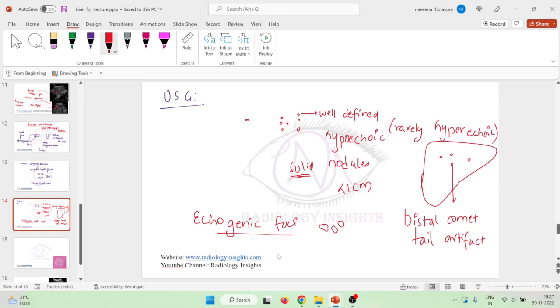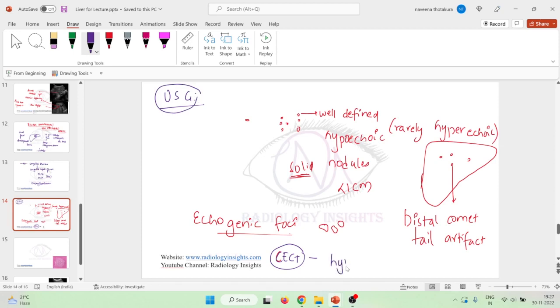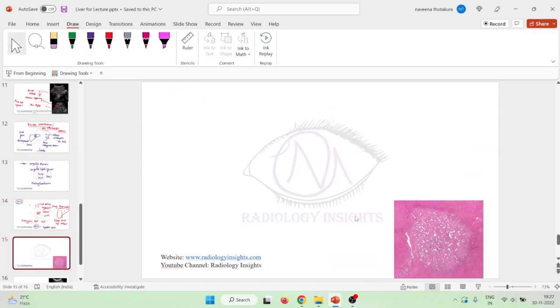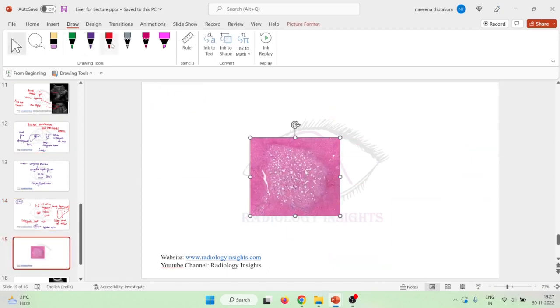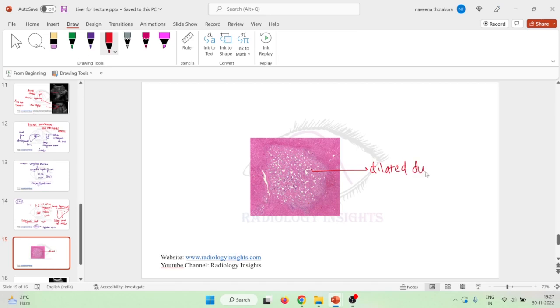If you do a CECT examination on these patients, we can see the presence of hypodense nodules on CECT. Histologically, these are actually dilated ducts, and these dilated ducts are surrounded by a pinkish material which is nothing but collagenous stroma.